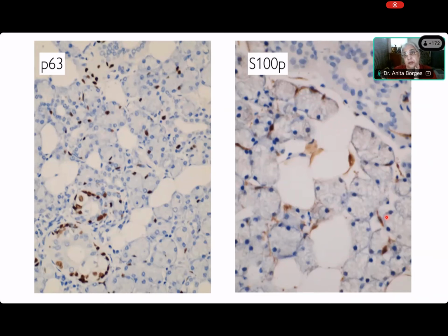And you can see here, there's a big duct in the top right-hand corner. Can everybody see that big duct in the top right-hand corner? And it has abluminal cells. You can see the two layers over here. But S100 protein has not marked the abluminal cells, and the word abluminal means away from the luminal, so lumen. So this is the second layer of cells, whereas it has marked the myoepithelial cells around the acini, as you can see over here. It's not marked the basal cells of the striated duct.